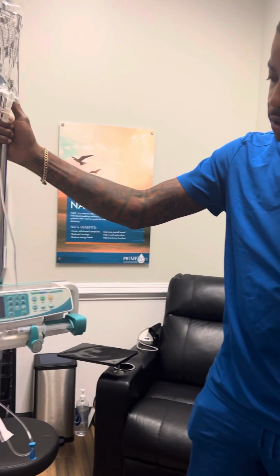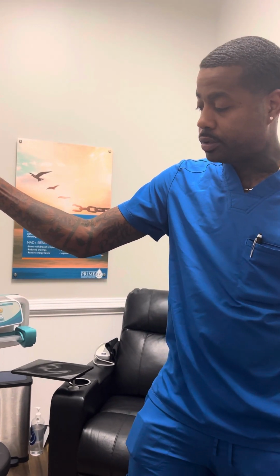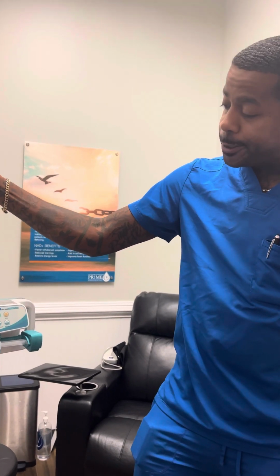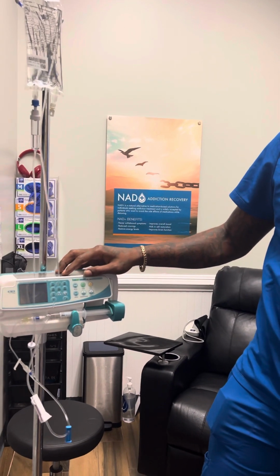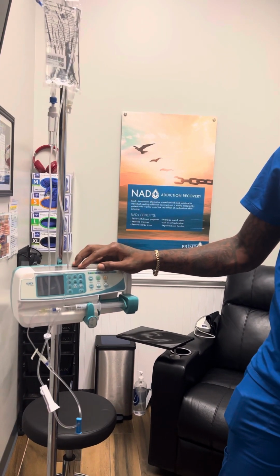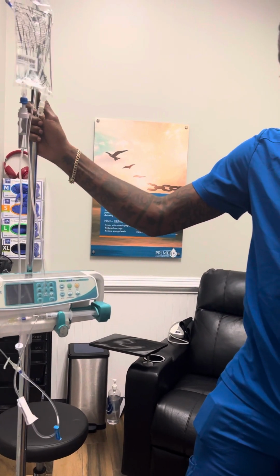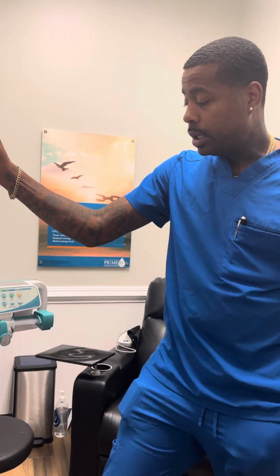I'm Kamal. We're here at Prime IV, and I'm going to give you a basic how-to on the syringe pumps that we use here. Very basic. So the unit, if it's low on power, it will not operate. So I would keep it plugged in overnight. It takes about 4 hours to fully charge, so you should get at least 6 hours out of it if it's not connected to AC power.